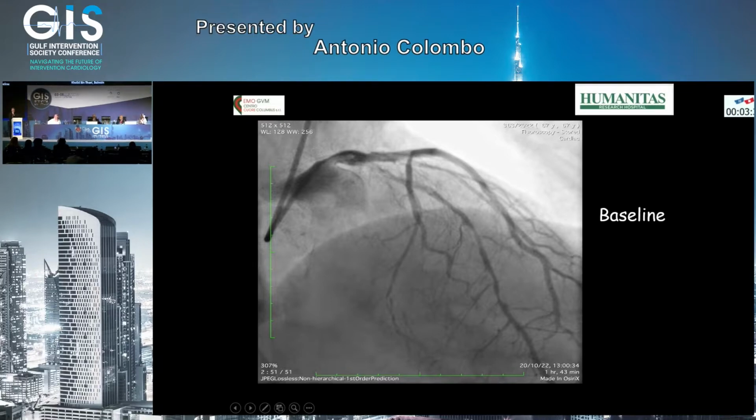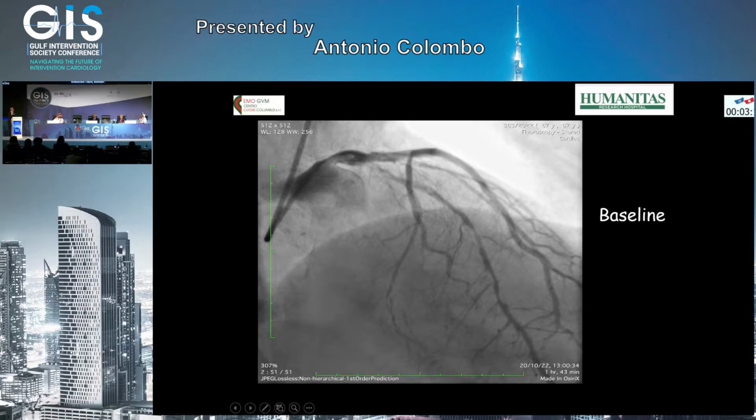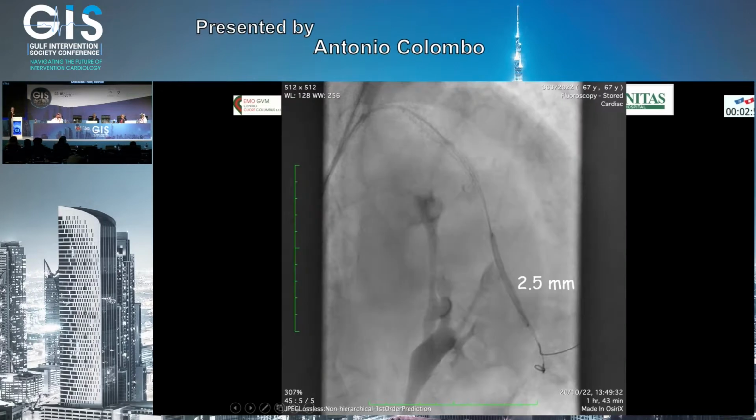Musa? Well, I think with this diffuse disease from proximal to distal, what I intend to do is balloon it, but the critical proximal lesion I stent, and then the distal I'll try to reserve for the future. If any surgery, then do a drug-eluting balloon for the distal. You can start from the distal part, after the third septal, with a small balloon to predilate, and then go higher with a bigger balloon, 2.75, at the proximal part, and see what happens.